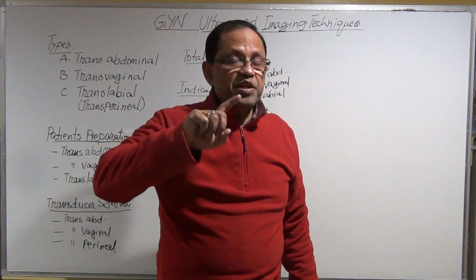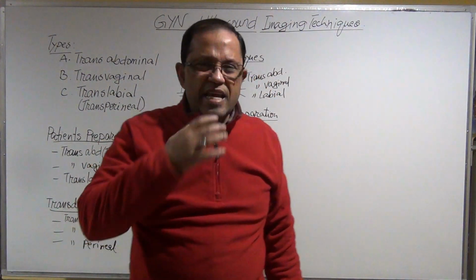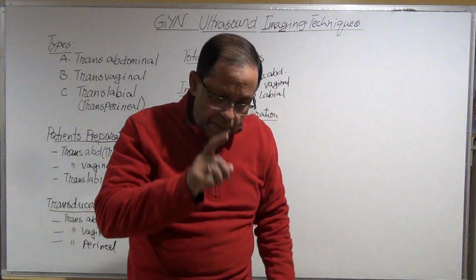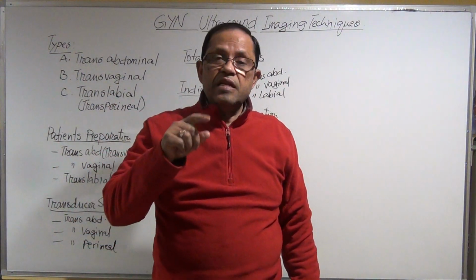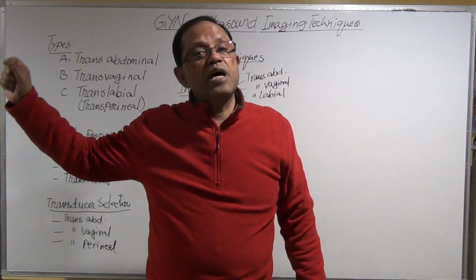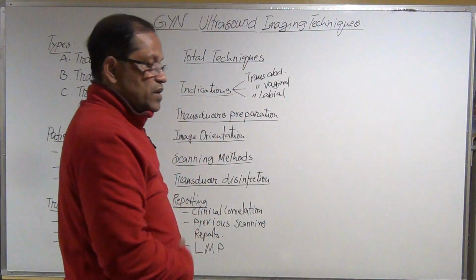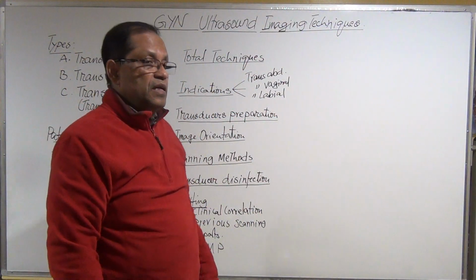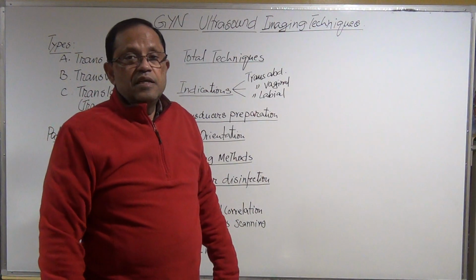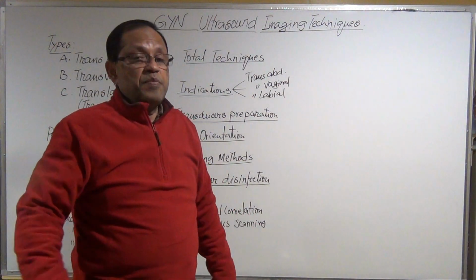No. Some patients get nauseated and cannot drink that much water. Some patients are instructed not to drink water because they came to the ER, the emergency room, with some acute abdomen, acute pelvic pain, and nobody knows, and the patient is also pregnant, and it could be an ectopic pregnancy, a ruptured ectopic pregnancy.